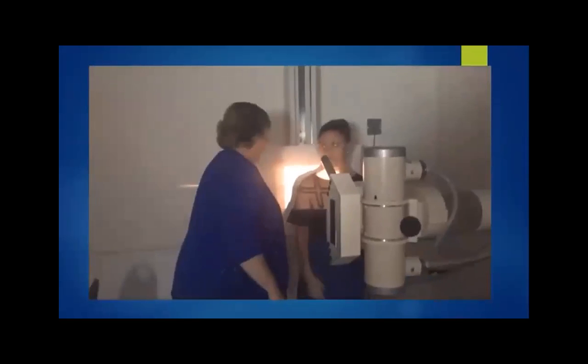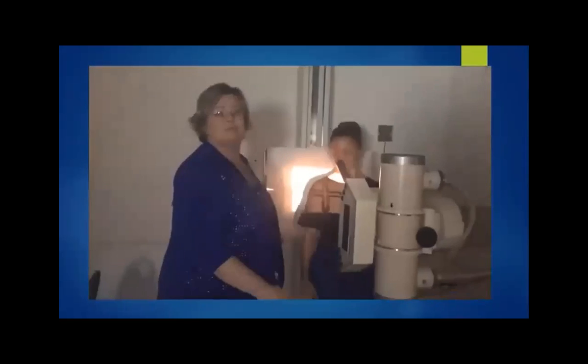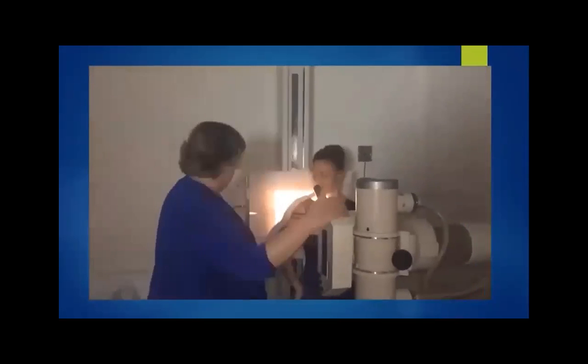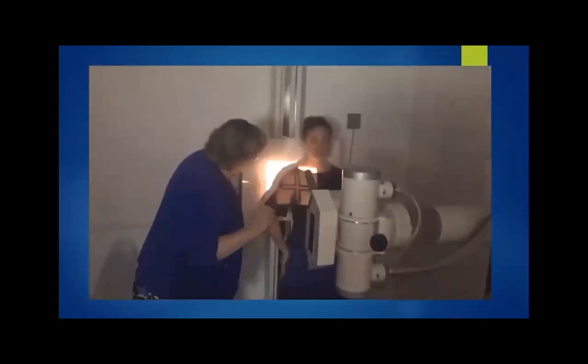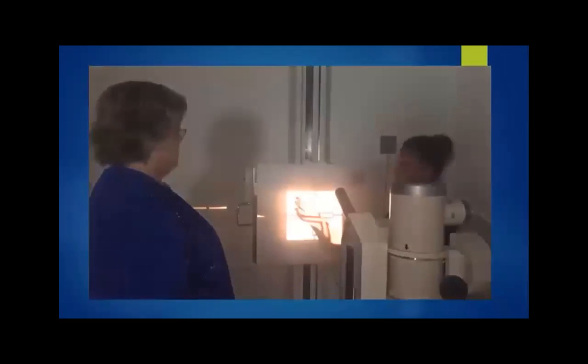That's our external rotation. Expose, hold your breath, don't breathe, don't move, expose. Switch out your IR. Internally rotate the hand until it's touching the back of the hip. And that is our internal rotated. Still 1 inch below coracoid. I'd bring her over just a slight bit maybe, but that's pretty good. Everything's centered. You have all around the shoulder on there. Room for your marker above. And that's our two easy AP views, internal, external, AP lateral.